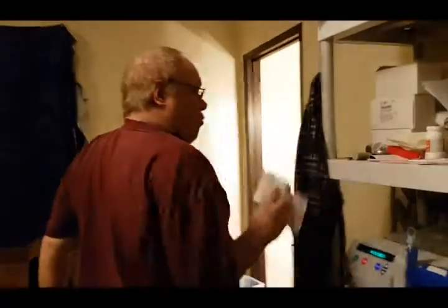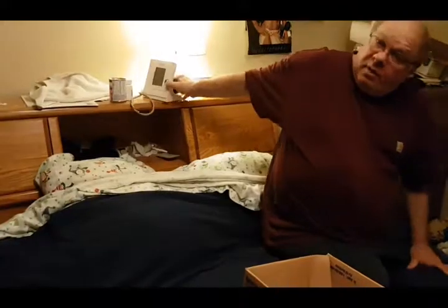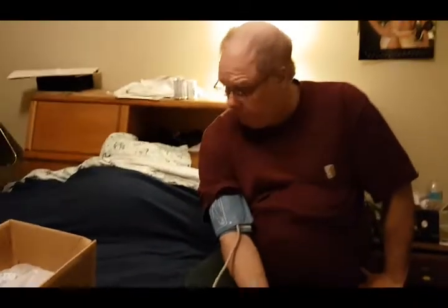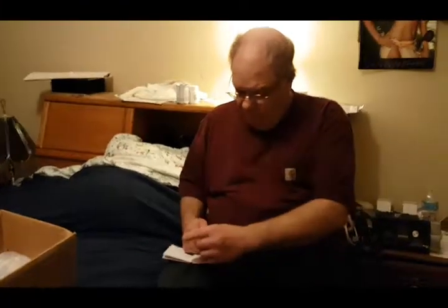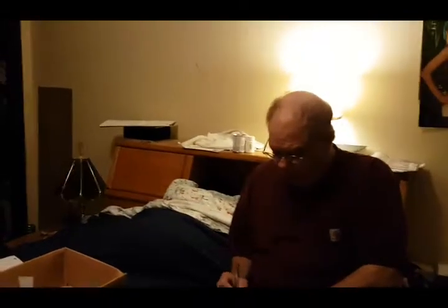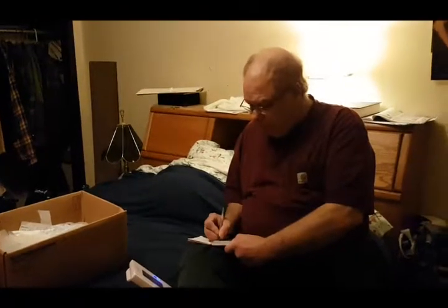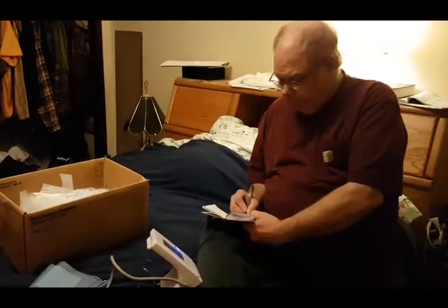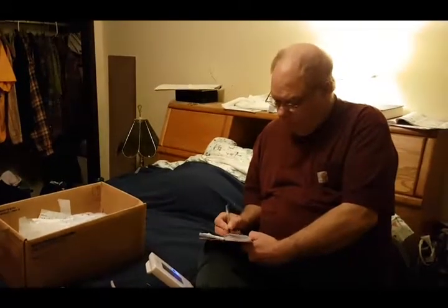So, well, I guess I'm going to do my blood pressure now. Grab the book. I got my cuff pre-sized. So I took my blood pressure. I'm recording my blood pressure and pulse. And then the other stuff, I tend to make notes, like I did 2 green today and 1 purple. So, yep.